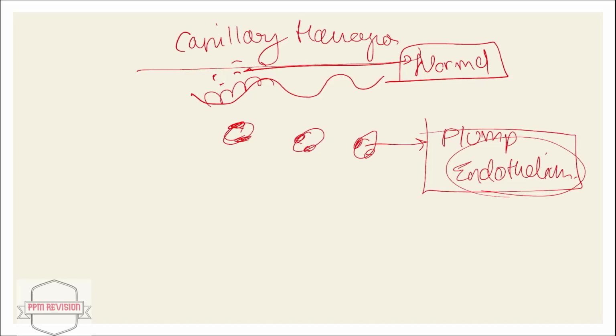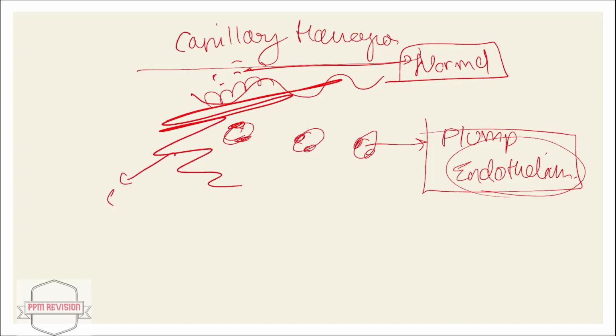Now moving ahead, looking at a few points: numerous small uniform blood capillaries with lumen lined by plump oval endothelial cells loosely supported by connective tissue stroma. So again, as usual, you can just add a stroma in almost everything. There's a plump endothelium, they have mentioned that, and then groups and sheets of proliferated endothelial cells.